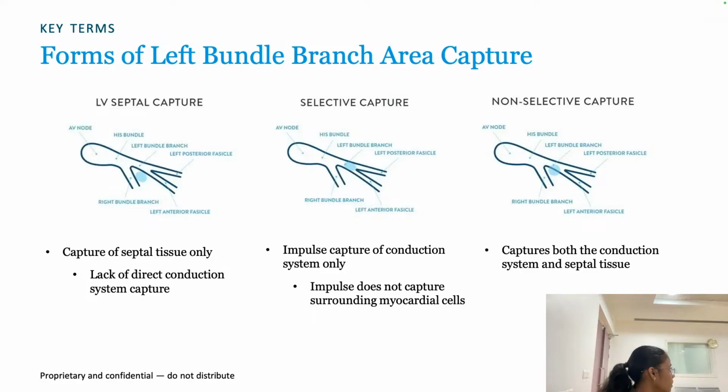How are you going to see it? We are going to measure from the peak of the QRS to the end of the QRS, because the end of the QRS will be our RV capture. Okay. If you have it in the slide, just show me that also.